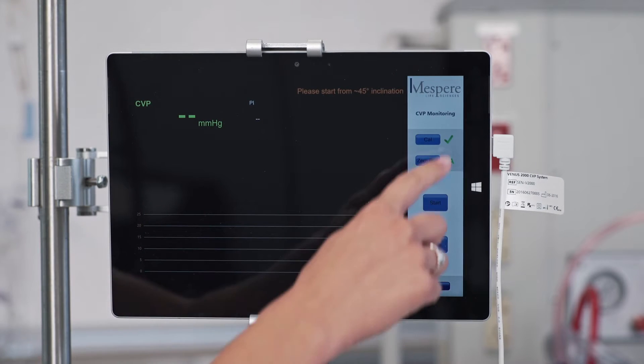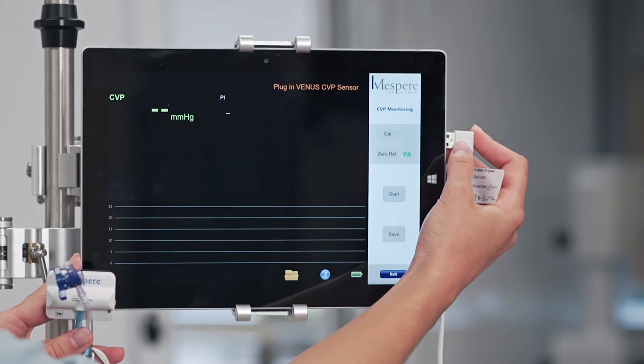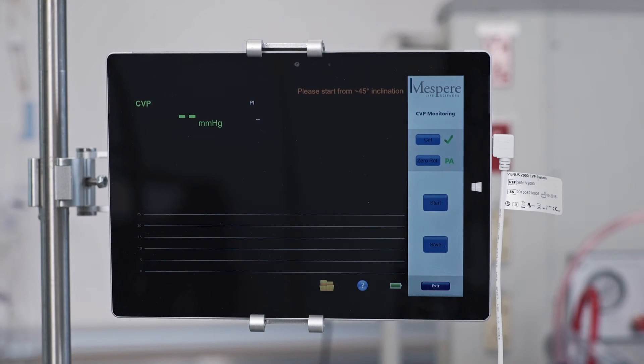A green checkmark indicates that calibration is not required. If calibration is required, a 'Please Calibrate' message and orange caution triangle will appear.